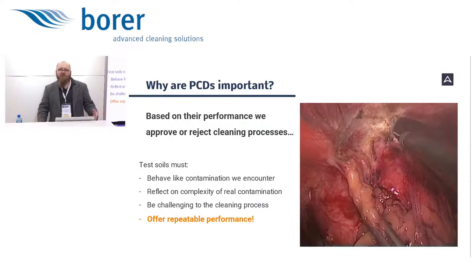If we assume that our goal in general is to deliver safe and sterile surgical instruments to our patients, I wanted to compare it to a situation that I deal with on a daily basis, having an 8-month-old child. When you take a child on a trip, what is important is that the child reaches the destination with you. So our sterilization indicators would be similar to our grandparents who welcome you when you get there, see the child and tell you that they are okay, looking lovely, and so on.